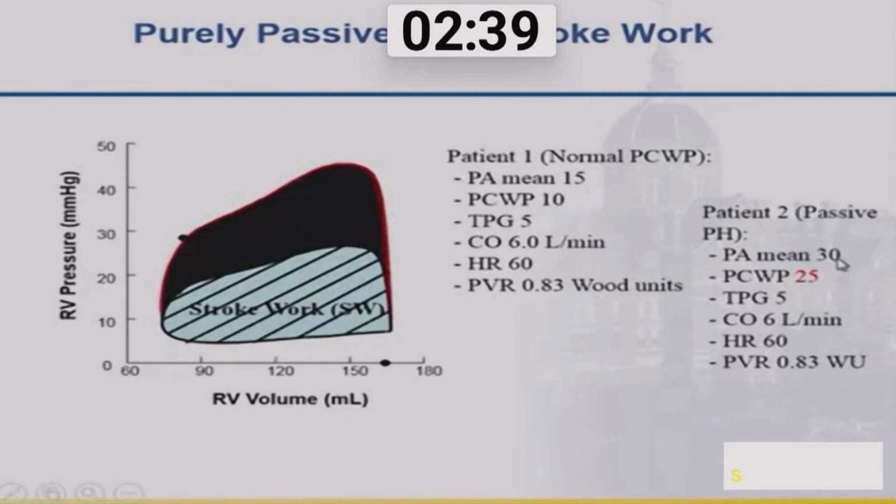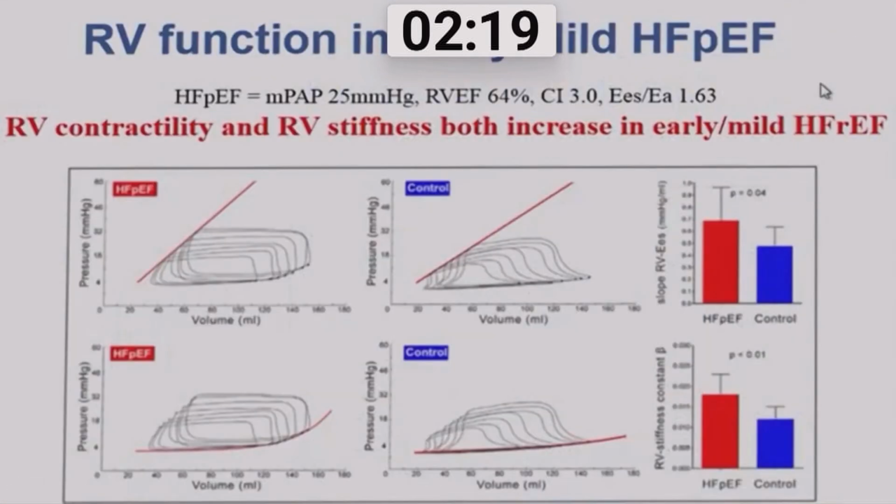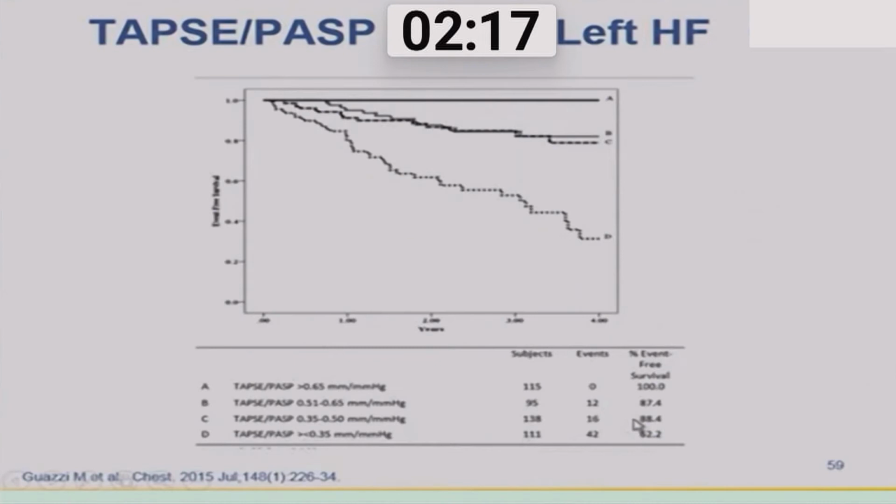And if we look at this curve, normally this patient's pulmonary pressure volume curve would have operated in this way. But when we have increased pulmonary pressure, as we had for this patient, the curve will move like this. And every possibility that this patient was having uncoupling. So can we measure this uncoupling by echocardiography? This is an uncommon practice.